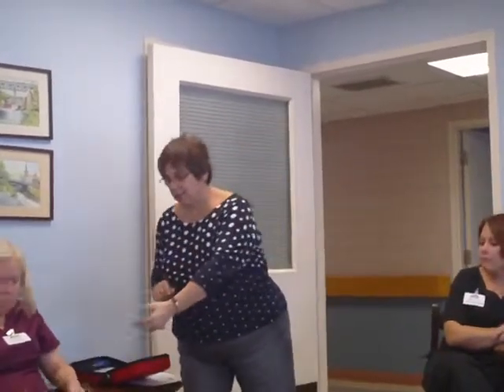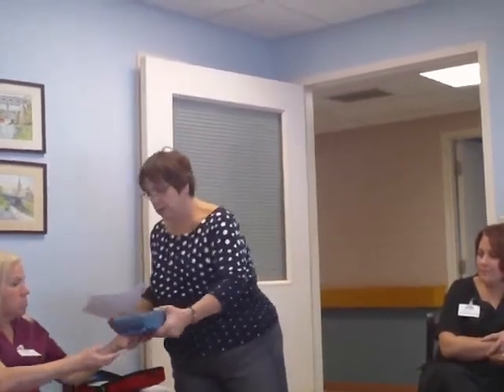So that's really probably only things that I changed. The little I button in the middle there is for instructions. If you need instructions, it's supposed to tell you what you need to do. It looks like the type they have on airplanes. And that would stay on the code cart. We wouldn't just transport the AED, so somebody doesn't just grab the AED. That's why the policy says the crash cart will be transported. The pads do have expiration dates.